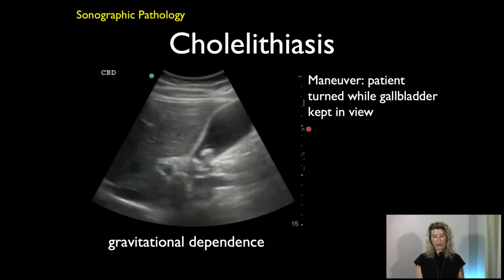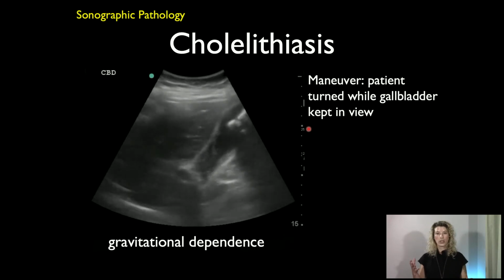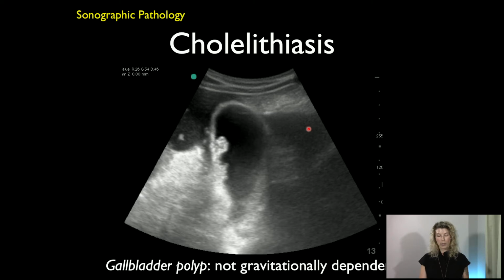Stones are gravitationally dependent, as was said. So this is a clip of a patient being turned, and you actually watch the stones moving. This is a polyp, and this doesn't move. So as the patient's being turned, this won't go anywhere. So it's a good way to differentiate.